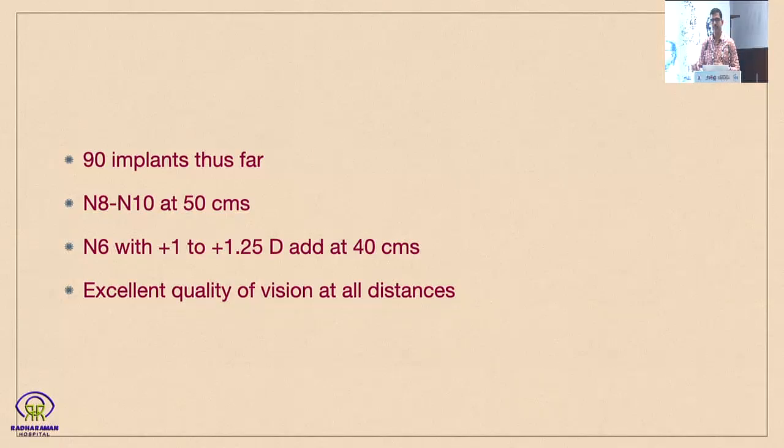So after bilateral implant, if say the phone is kept on the desk or even on the kitchen platform while the lady is cooking, the incoming call, the number from where the call is coming, is clearly visible on the screen without the assistance of glasses. They can also do their household work, the majority of them, without the assistance of glasses. For very fine prints, of course, they do need it, but it's again around 1 to 1.25, as I mentioned.